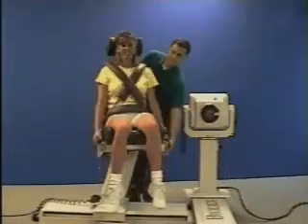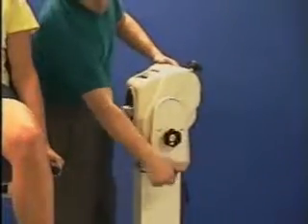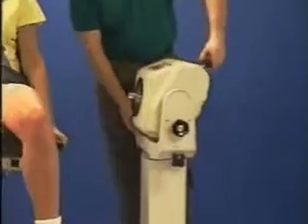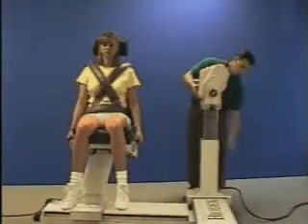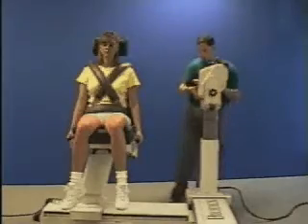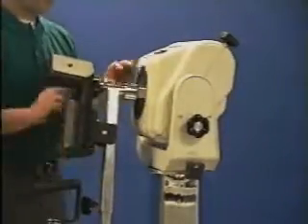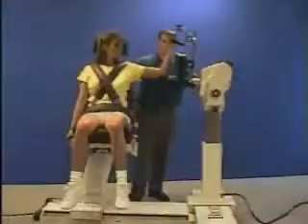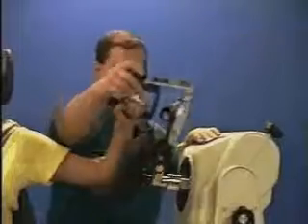Rotate the chair to the zero degree position. Rotate the dynamometer to zero degrees, labeled shoulder 90/90. Tilt the dynamometer to five degrees. Raise the dynamometer to accommodate the axis of rotation. Using the red dot, align the elbow-shoulder attachment and secure it. Move the patient into position, check the axis of rotation, and set range of motion limits.